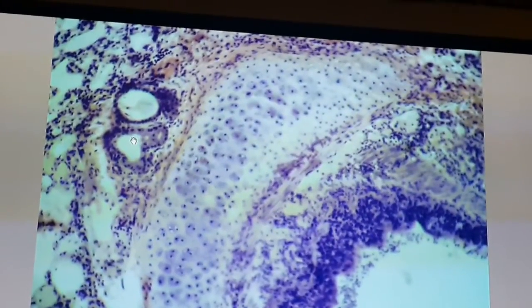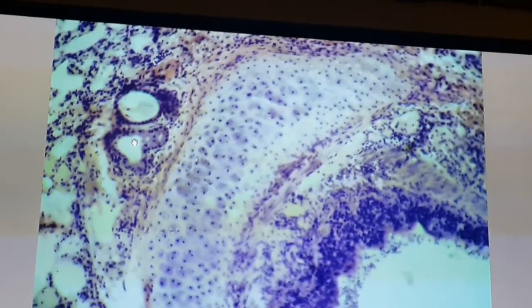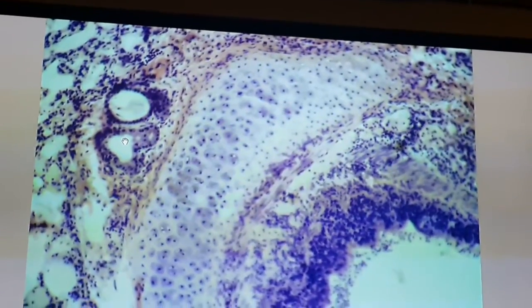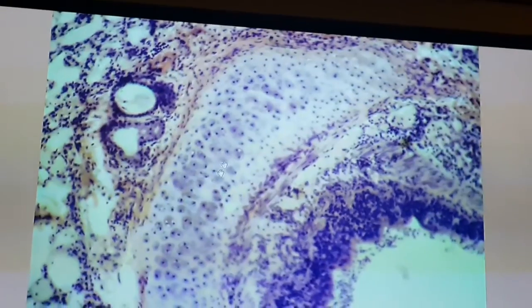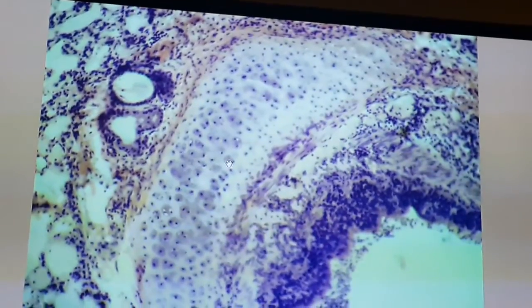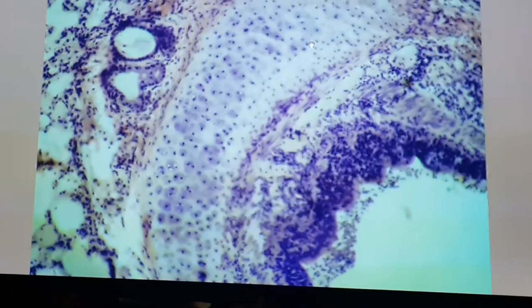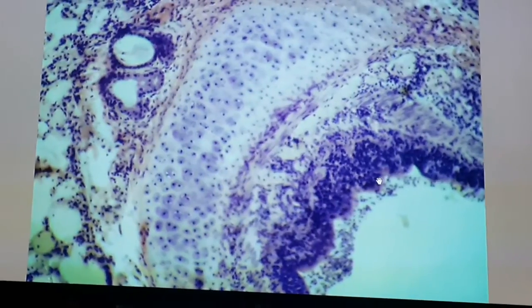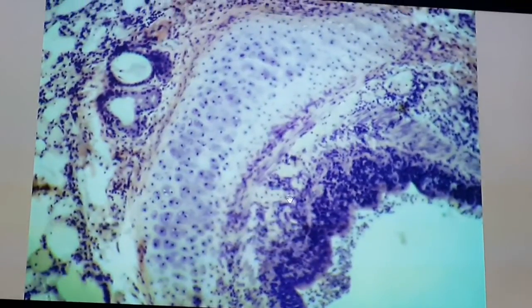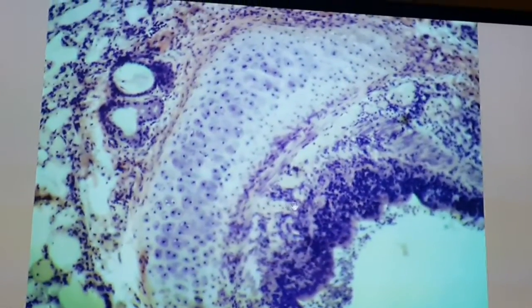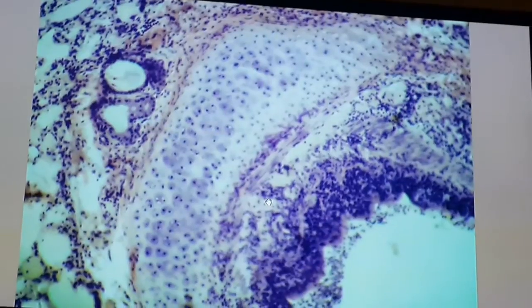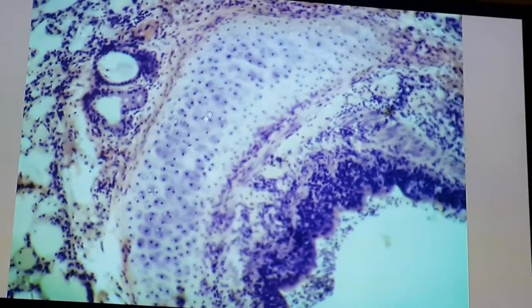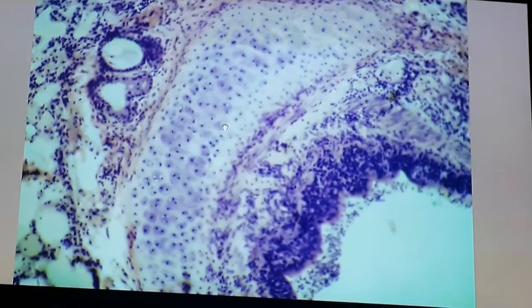This is an inter-pulmonary bronchus. As you go down, what will diminish is the following: the height of the epithelium will diminish, and the elements of glands in the sub-mucosa will start to diminish, and the cartilage pieces will become very small pieces.